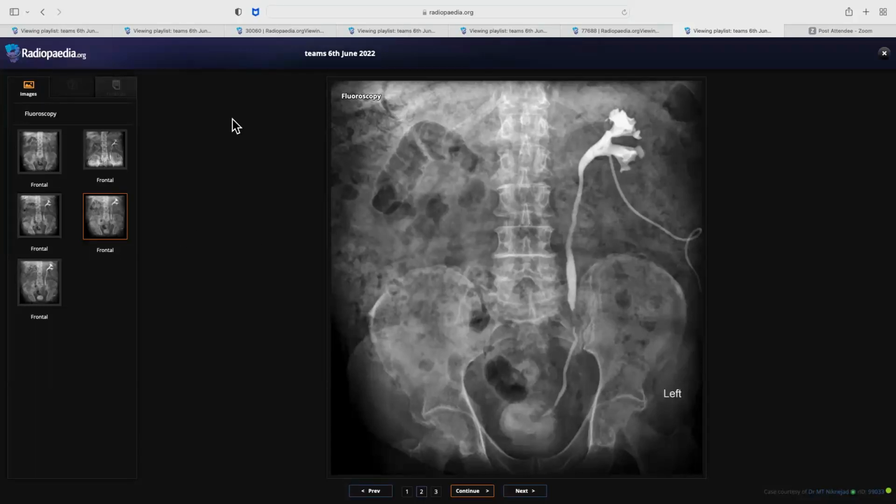Time is over. Okay, so let's start from here. So very well done, Dr. Samit. So this case I basically showed because, you know, instantly everybody calls it IVU. Despite the fact that they are not doing conventional procedures a lot, we still do encounter such cases in exams. That does happen. Suddenly such cases pop up and we are not expecting that.